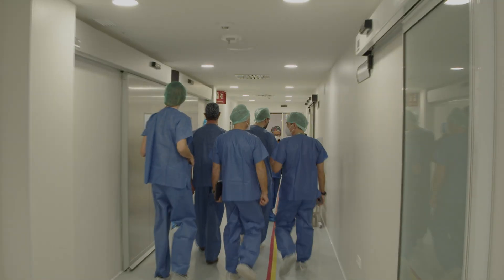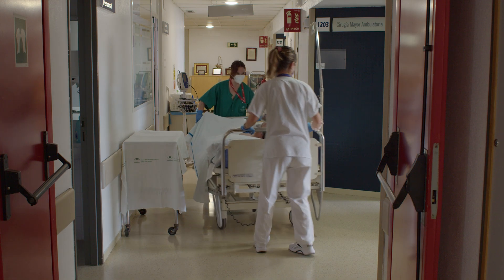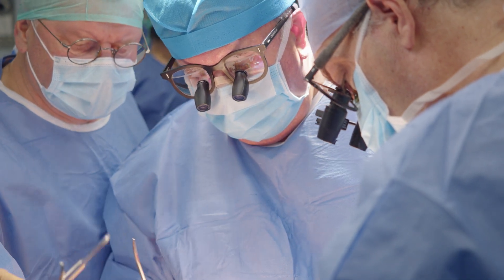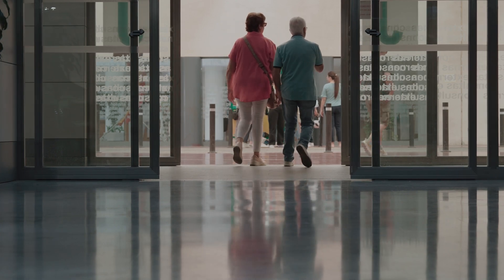After surgery, the patient remains in the hospital for 24 hours for proper monitoring before being discharged with comprehensive recommendations. As you can see, when performed by a specialist, this procedure is safe and indicated for patients with life-threatening arrhythmias.